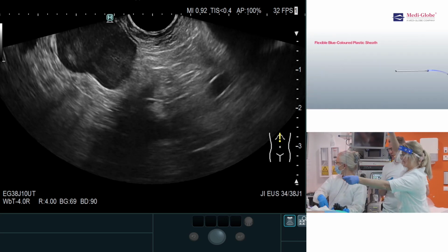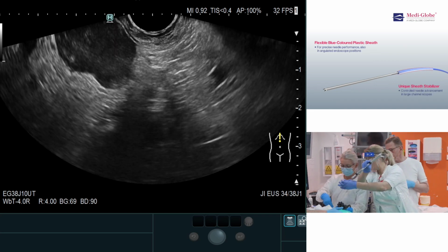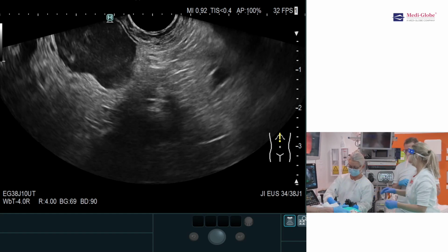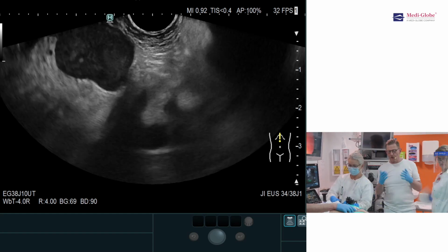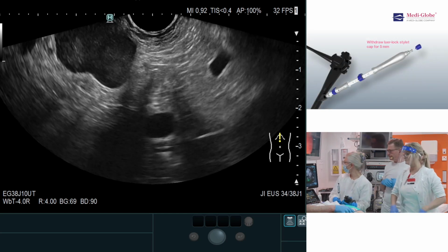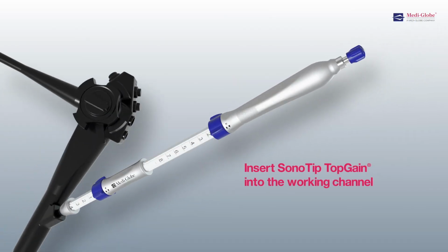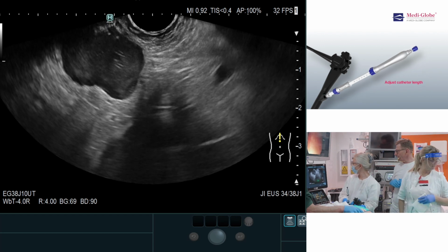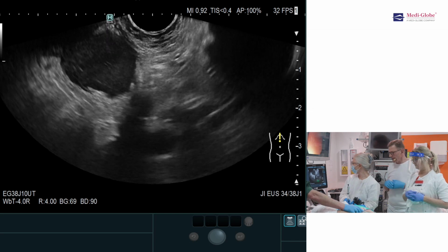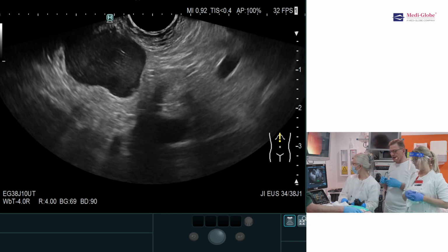It is shown that for GIST tumors, the method is quite in favor of third generation FNB crown cut needles, and therefore that's what we are going to be using. Now, first Lene will do the position of the sheath lengths in order to protect the endoscope. And I think maybe the patient is going to have a little more anesthesia. He's moving just quite a little.